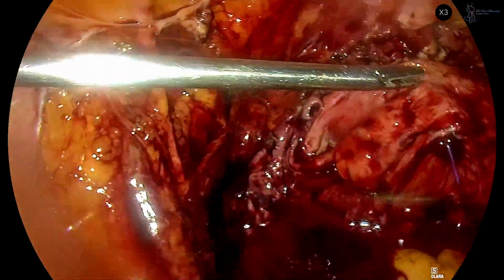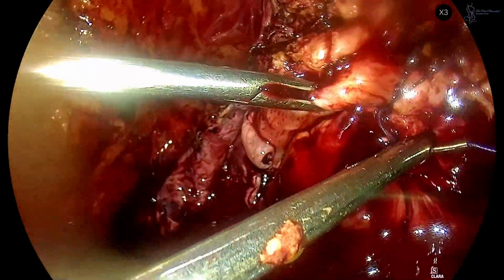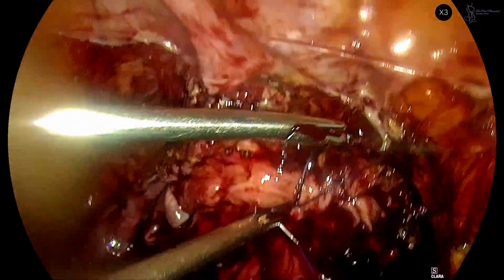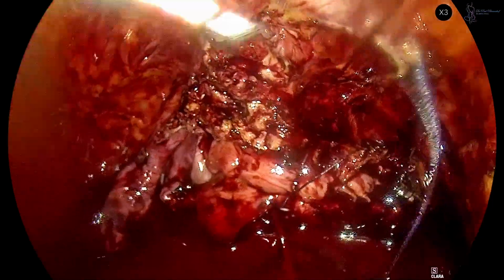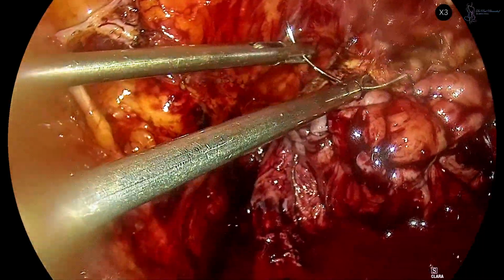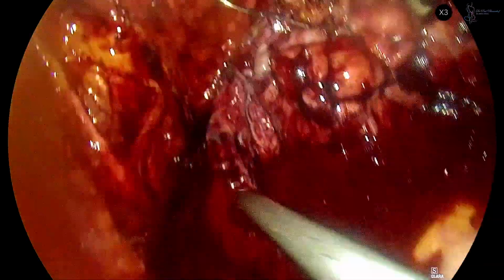Absorbable Vicryl sutures were used to approximate the vaginal edges, ensuring secure closure. Adjusting the needle to the proper alignment to facilitate smooth and secure knot tying.